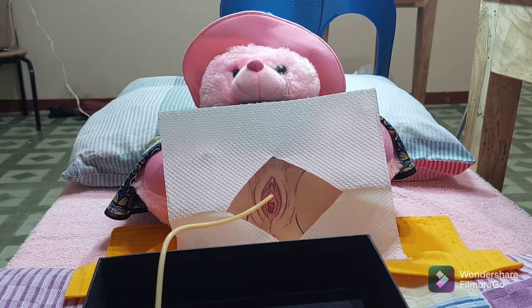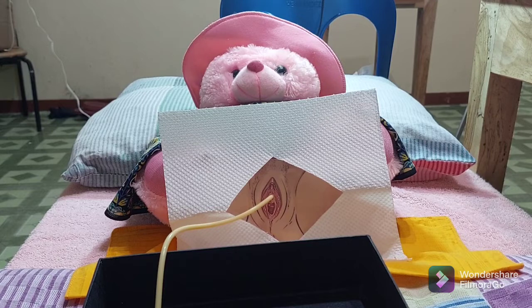Secure the catheter to the patient's leg using a securement device to the tubing just above the catheter bifurcation. In female patients, secure the catheter to the inner thigh, allowing enough slack to prevent tension. In male patients, secure the catheter to the upper thigh, allowing enough slack to prevent tension. Ensure the foreskin is not retracted. The rationale is that securing the catheter reduces the risk of CAUTI, urethral erosion, and accidental catheter removal. For male patients, leaving the foreskin retracted can cause pain and edema.